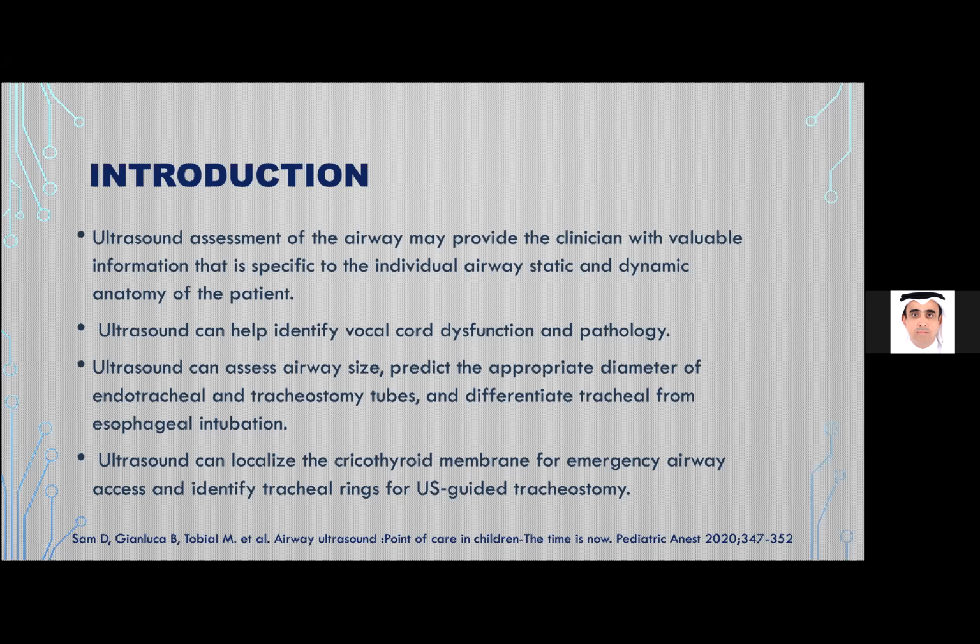This patient will have a difficult airway, so prepare yourself for the bad scenario if you think this patient is not easy to intubate. So we will see the tonsil and the submandibular gland, and this is the artifact of the mandible. Okay. After you finish this, where will you go?